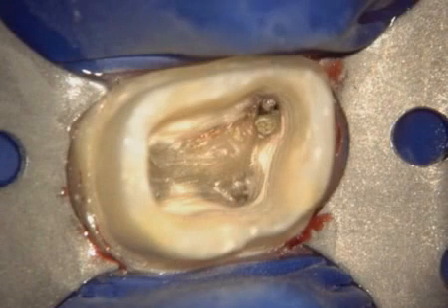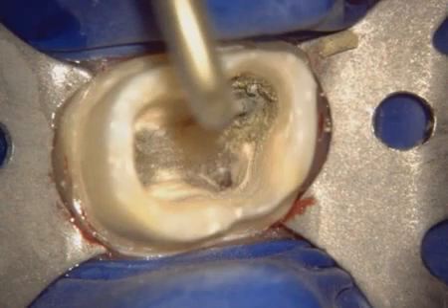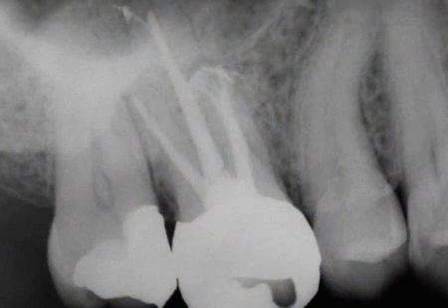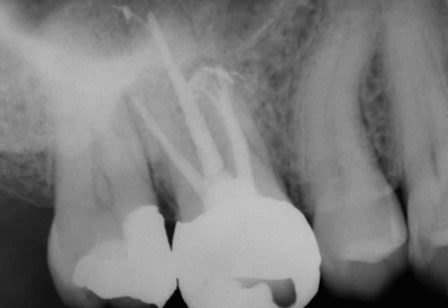The handle of the 20 file is sectioned off to give us a better view and unobstructed vision during perf repair management. MTA is introduced lateral to the instrument and can be vibrated with direct ultrasonics. On a subsequent visit, the conveniently sectioned file can be removed. The MB1, MB2, and DB and palatal systems were cleaned and shaped, and the case packed in 3 dimensions. Note the perf repair and all the portals of exit sealed.